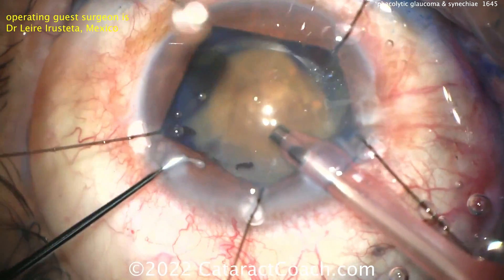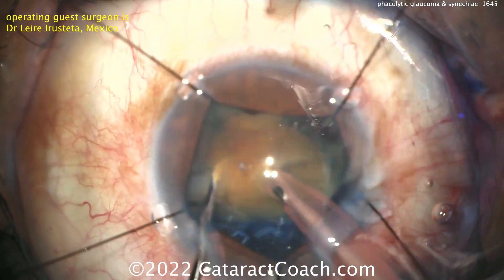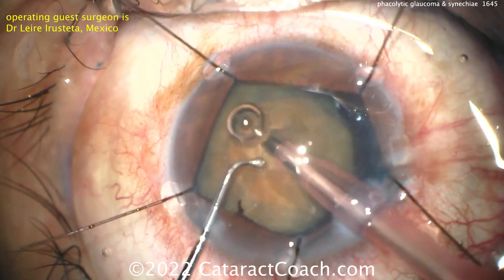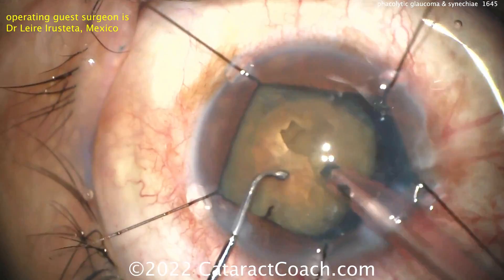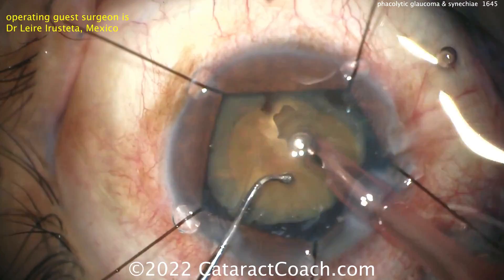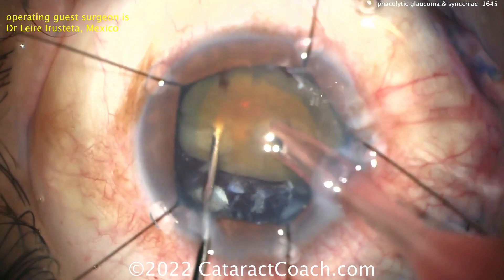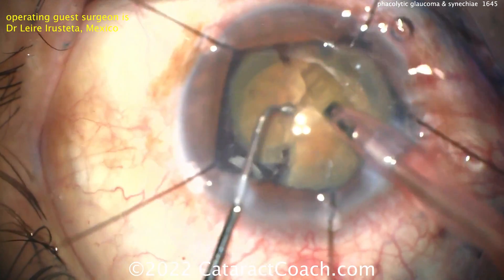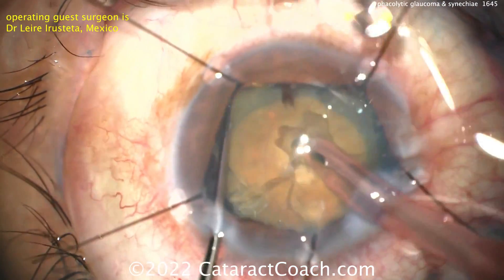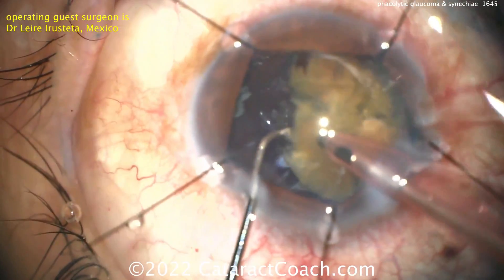Faco probe going inside the eye, and a chopper as well. A nice horizontal chop — horizontal chop is a good choice here because you've got to trap that nucleus. If you didn't get a full chop right away, that's okay. Buzzing with the probe again, get that chopper way on the other side, and you may want to just trap the nucleus between the faco probe and the chopper. You don't want to rely on just the vacuum holding power — you want to actually trap that nucleus between the two instruments, because you can exert far higher pressure. I like the idea of a groove to really get that probe in deeper, trapping the nucleus between the two pieces so opposing forces can be brought together. A very nice technique.